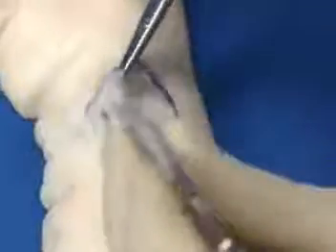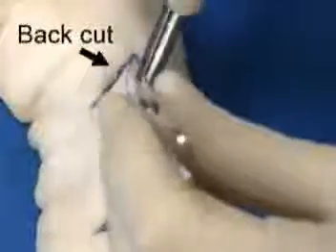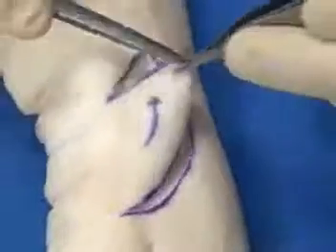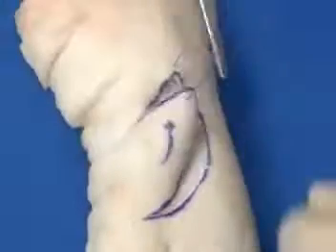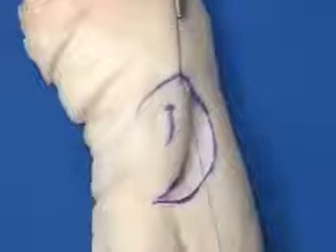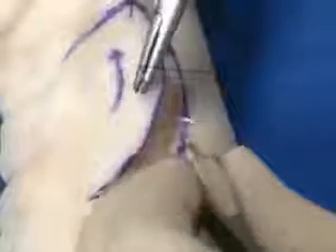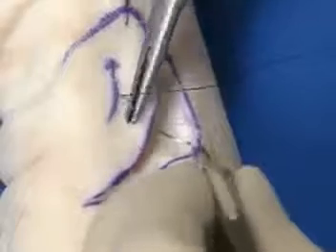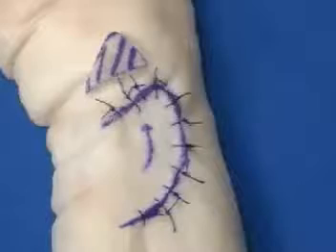Test rotation can be done intermittently during flap elevation to determine whether the back cut is enough. The key suture is then placed. An instrument tie can be used with this flap design because there is not a significant degree of tension. The flap edge is then closed to the longer skin edge using the principles of halving, splitting each side in half for subsequent suture placement.